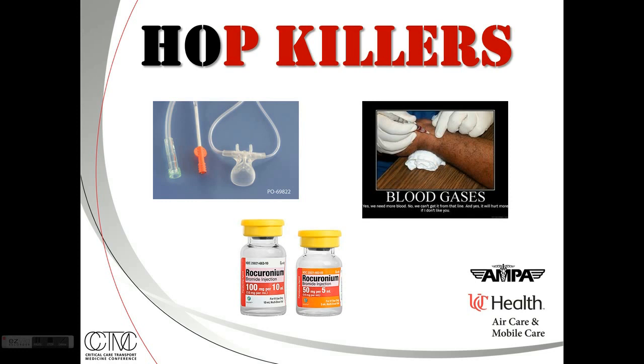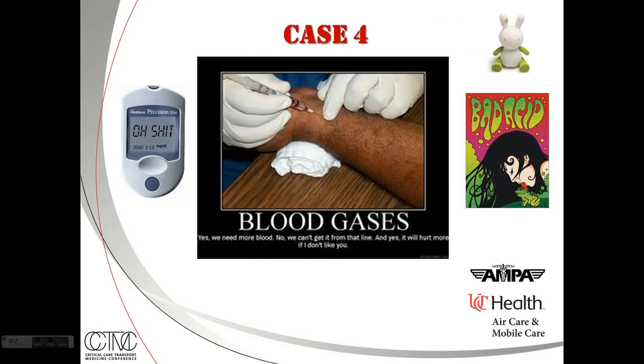So getting back to the case, we go ahead and position the patient optimally so that we can nail the intubation on the first attempt. And we decide we're going to use the ventilator strategy. So we've got them very well pre-oxygenated. We use SIMV at a rate of 0 to do that pre-oxygenation, essentially doing BiPAP. And then once we push our induction and our paralytic agent, we increase that rate up to 12. So that end-tidal stays rock solid right where it is, which we know in real time during the RSI because we've got a capnography cannula to do our apneic oxygenation.